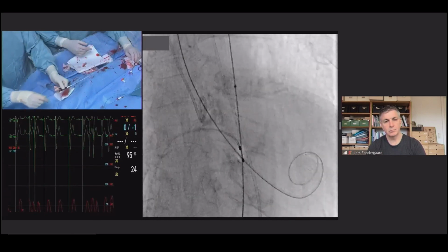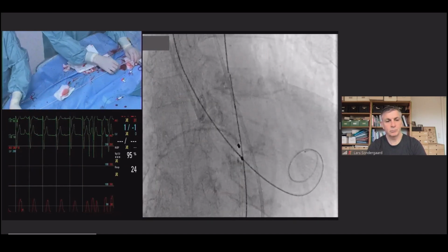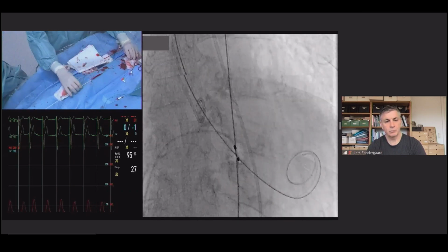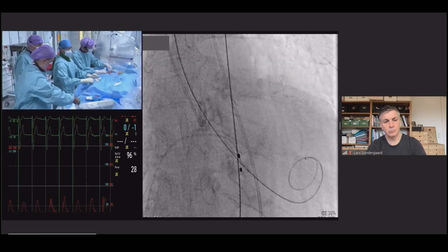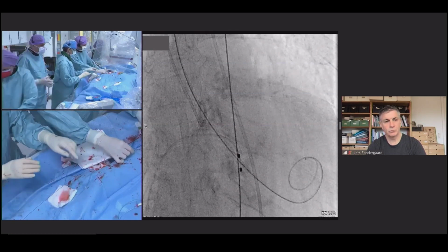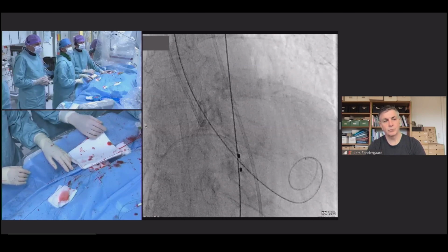So you saw that just the balloon inflation caused a 3rd-degree AV block here. We knew the patient was at risk due to the pre-existing incomplete right bundle branch block. And that is, of course, also why we chose to have an RV pace lead in this case. She gets her own rhythm back. Then try to come down now and see whether she's back here.